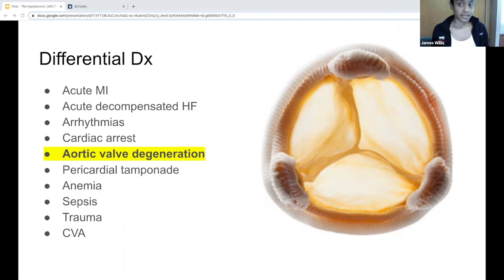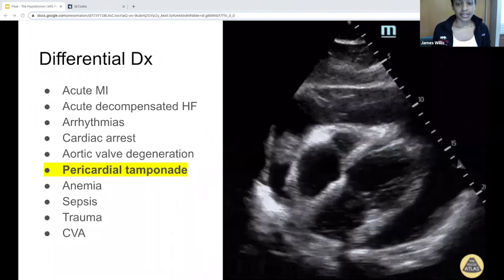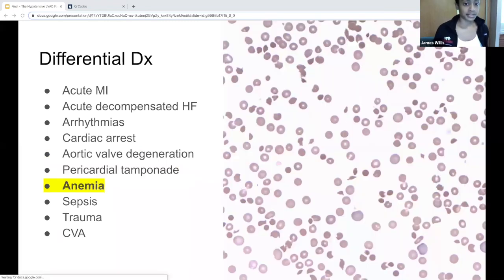It happens because of increased mechanical stress on the valve and artificial blood flow, which eventually leads to regurgitation. Pericardial tamponade happens as a result of dissection or trauma. Spontaneous bleeding into the sac is rare, but can occur if they're post-op. Don't do a pericardiocentesis on them unless it's very clearly tamponade because of the risk of device complications.